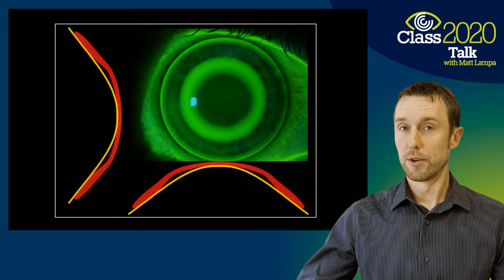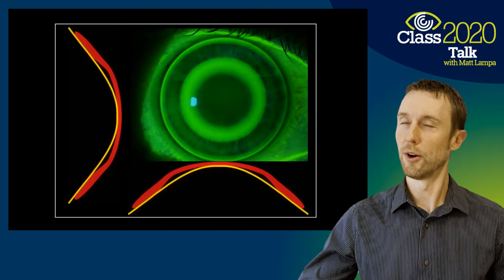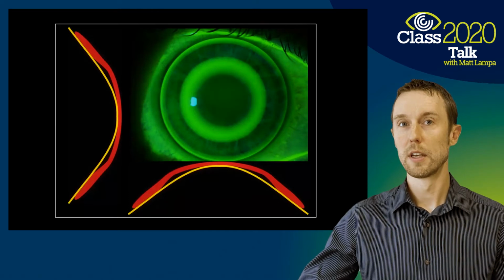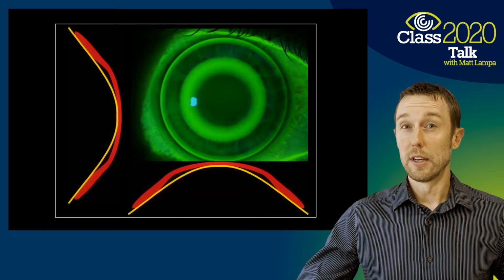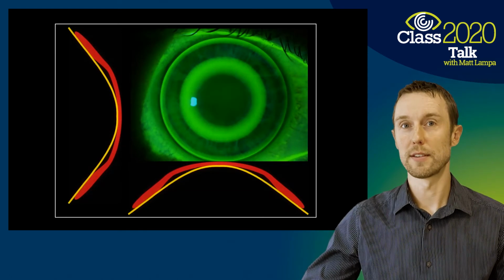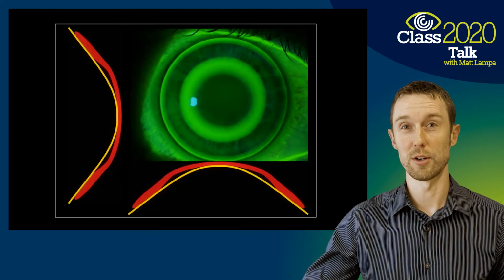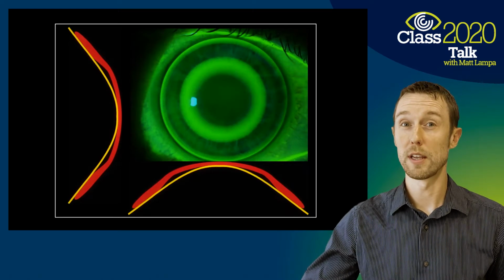The other thing that we're doing by landing the contact lens equally is ensuring, or hopefully ensuring, centration of the contact lens. The way in which an orthokeratology lens is constructed, if we think of it from the center out, is in the middle. That central base curve is really best thought of as the treatment curve, the mold curve. That's the curve that we're wanting the cornea to become.